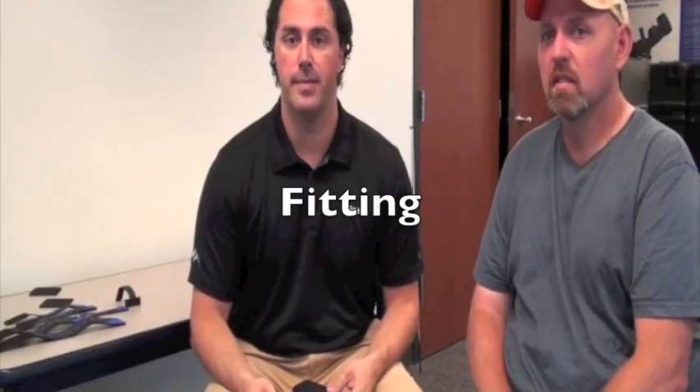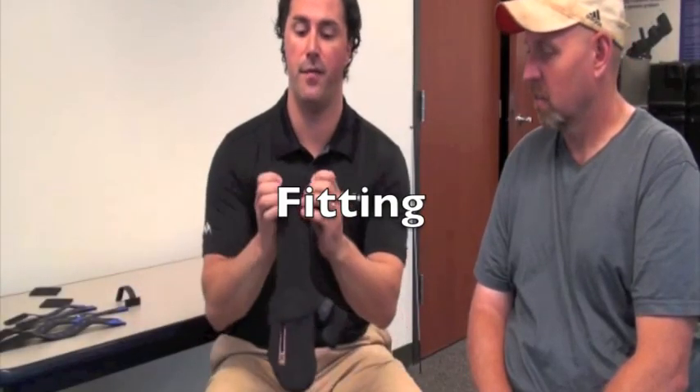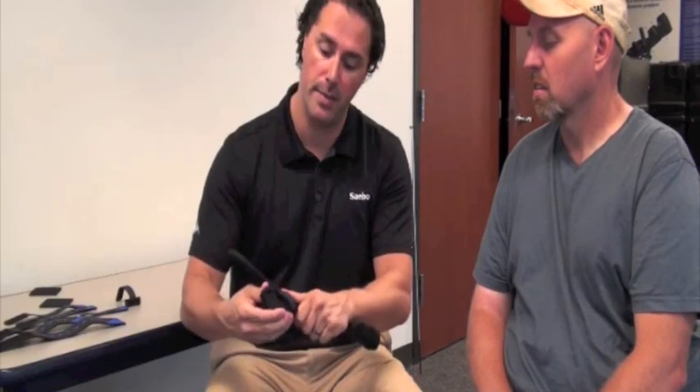Now that we've bent the wrist mount, it's time for the fitting. The first thing you want to do is bend the forearm stabilizers and bend the thumb mount. To bend the thumb mount, simply grab it, bring it down just a little — you don't need to bend it too much — and then bend the thumb stop in.